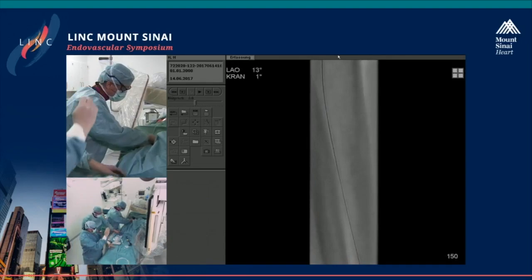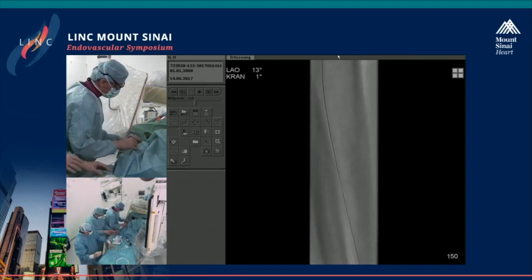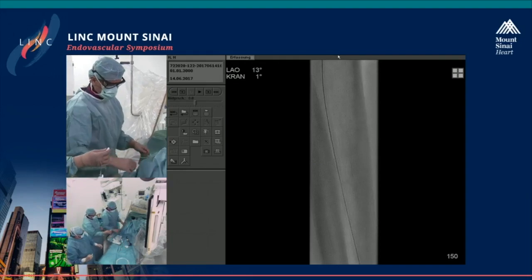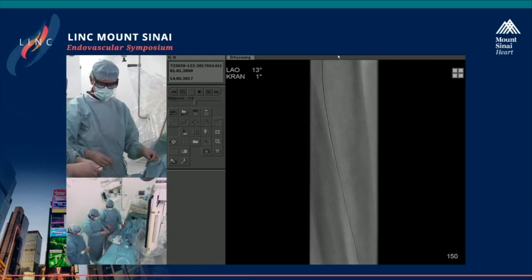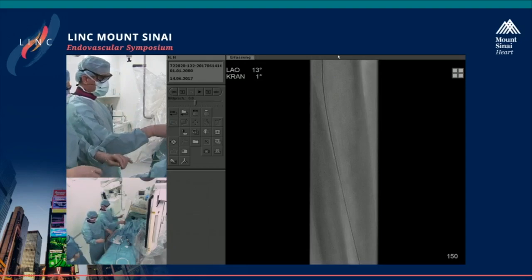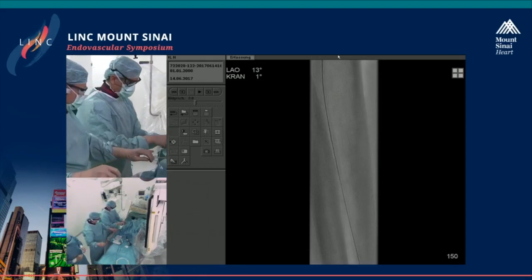So now the sheath is in. I take the dilator out, and there is also already some back bleeding here. And now, we take the valve on it. So Andre, when are you using a sheath for retrograde tibial access, and when do you avoid the sheath and just go with the support catheter? What's the advantage of a micro sheath?